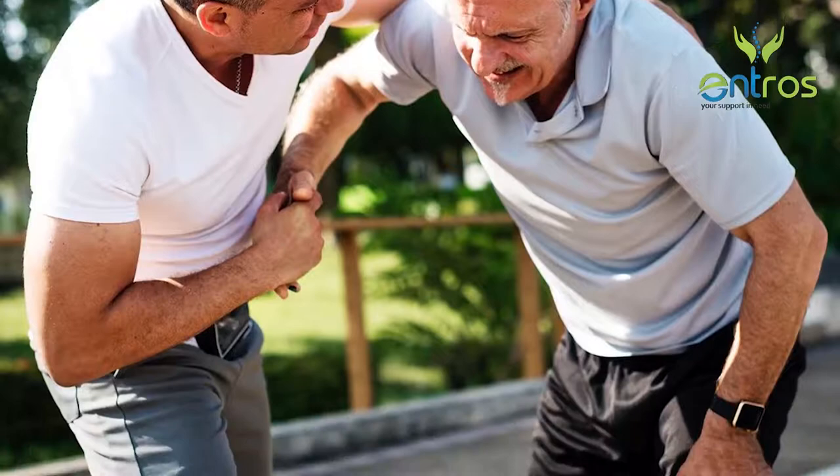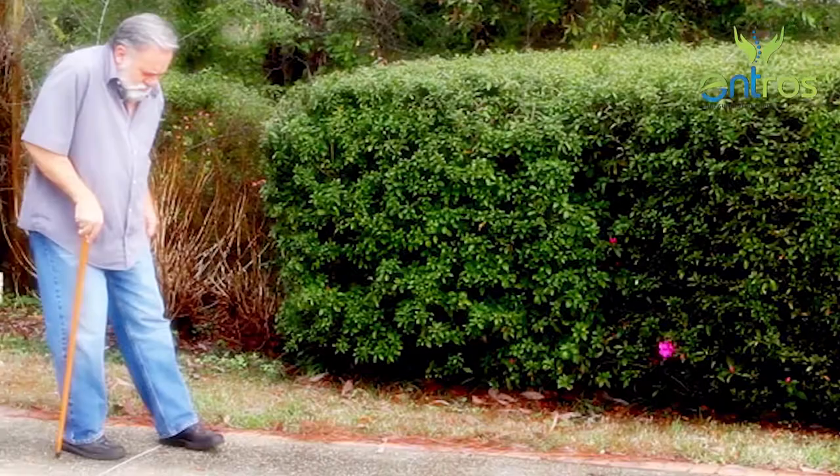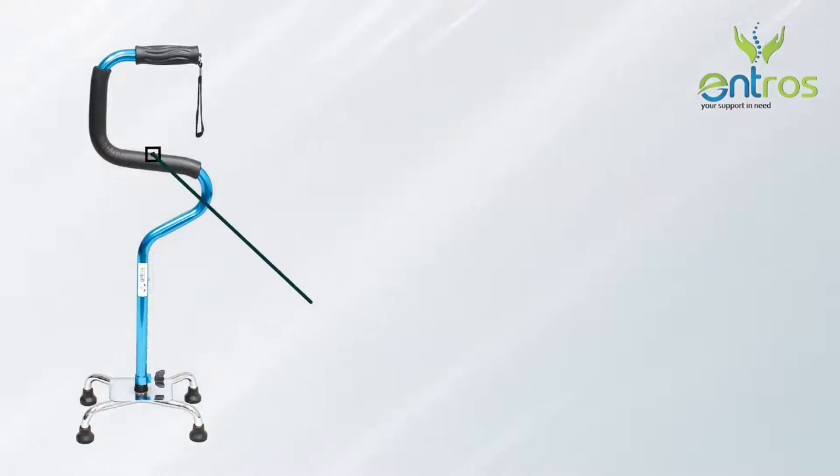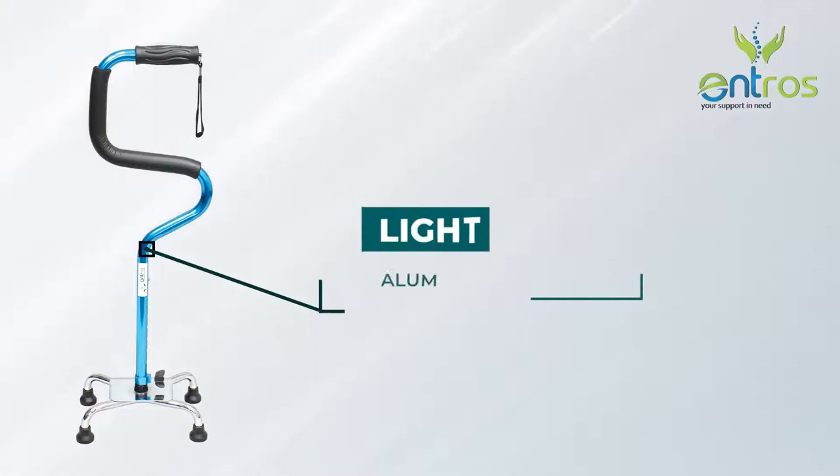At a time when you may need assistance to walk or move, taking the help of a walking stick can make life much easier while keeping you independent and confident. Intros introduces a premium quality adjustable height walking stick that has a suction rubber bush at the head for better grip. It has an elegant curved look to carry the stick either from the upper or middle portion.